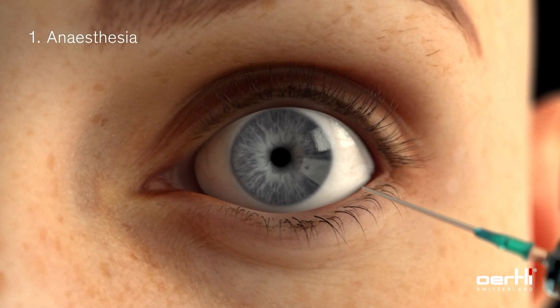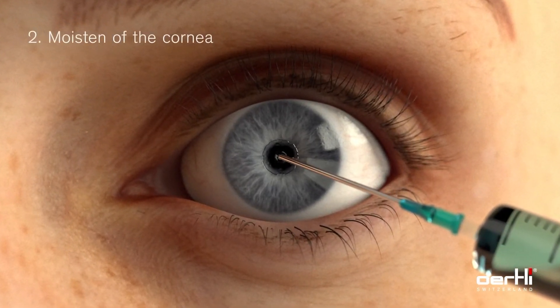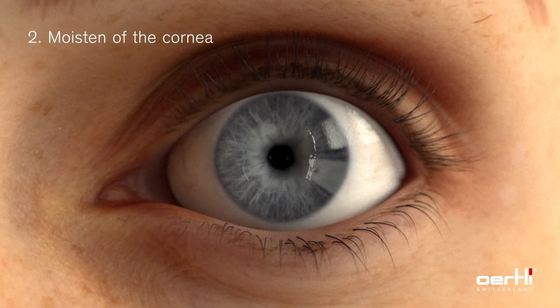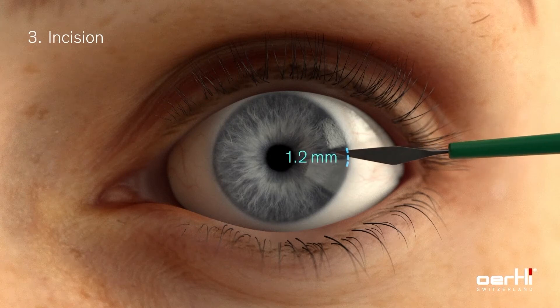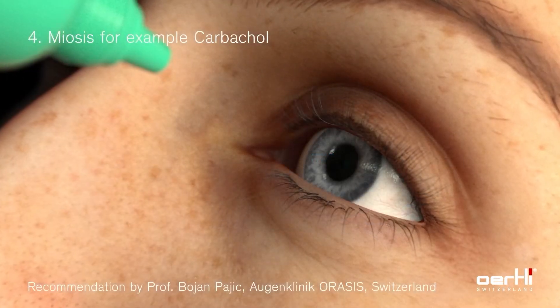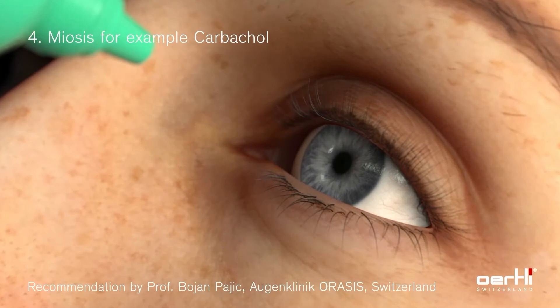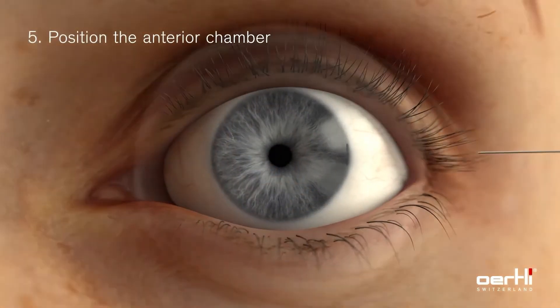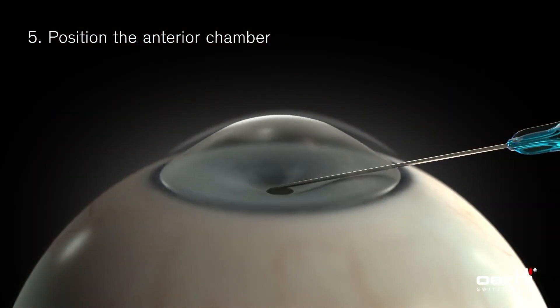The HFDS procedure can be carried out under local anesthesia. Methicel or viscoelastic substance is applied on the cornea. Make a temporal incision. It is recommended to narrow the pupil with drops or by intracameral injection, for instance with carbacol. In addition, fill the anterior chamber with a high viscosity viscoelastic substance.